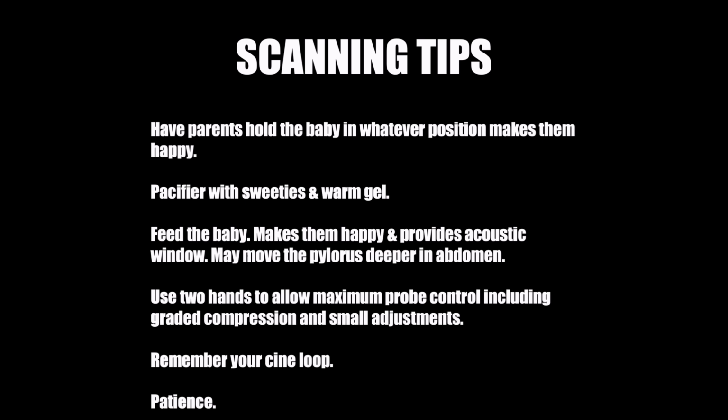Do be aware that when you feed the baby, a lot of times it's going to make the pylorus pitch down deeper into the abdomen. A lot of times it's going to go almost vertical, but that usually is well worth the better window that you're going to get. This is an exam where I will often use 2 hands to scan.